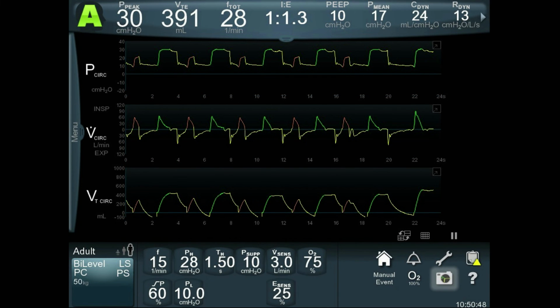Finally, you can see here in this particular picture, this looks a whole lot like SIMV pressure control because every second breath is pressure supported with a pressure support of 10 versus the driving pressure of 18 for the pressure control breath. So, it's quite a versatile mode of ventilation, but its closest relative in the spectrum of modes of ventilation is SIMV pressure control.